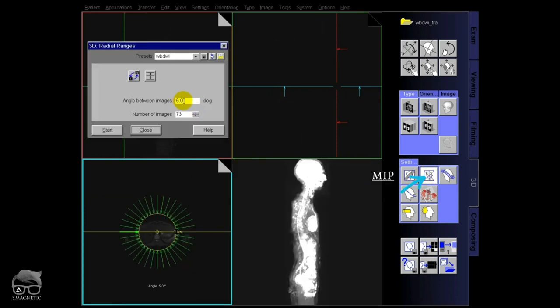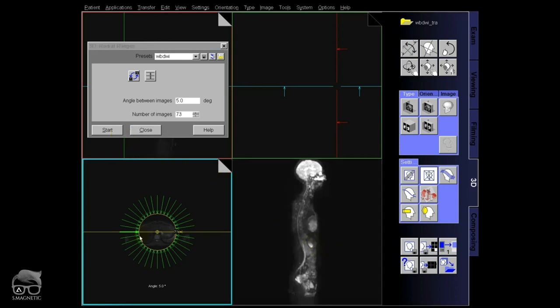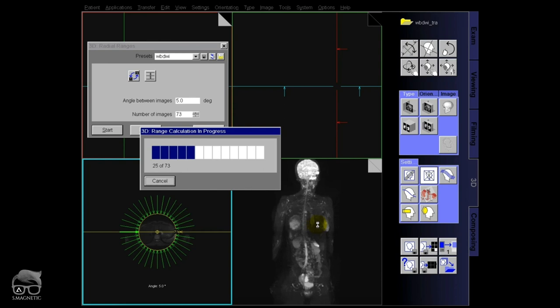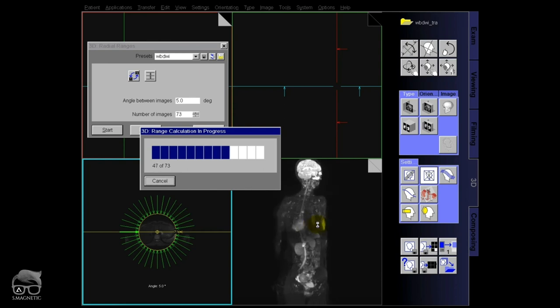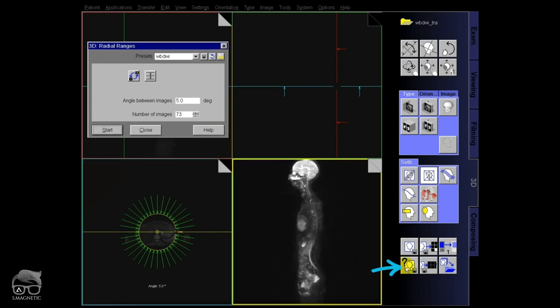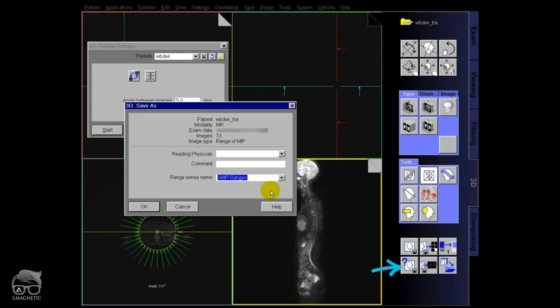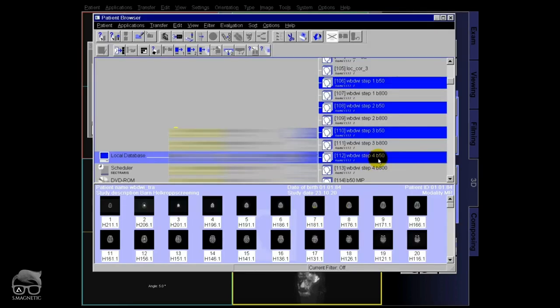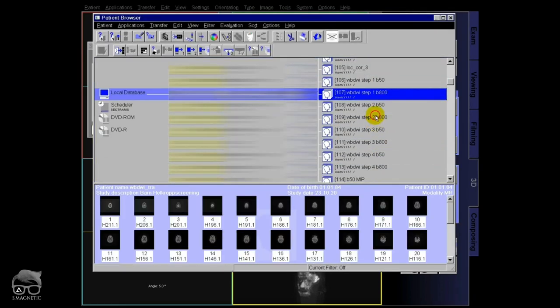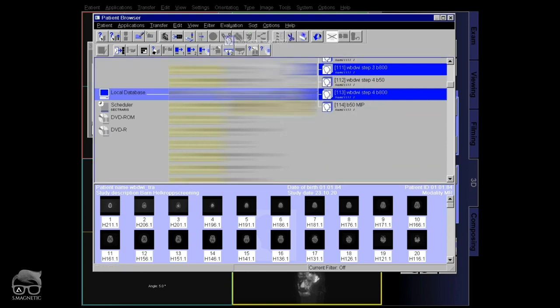Let's go for the MIP. What I did here is choose five degrees and a number of slices of 73, which means they go 360 degrees. This is also up to you — there's no right or wrong here. I'll save this one. My last post processing was the MPR, and now this is the MIP. I'll save that one too. And we'll do the same for b800 — just do a MIP.